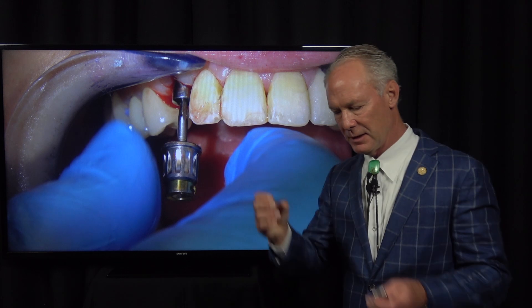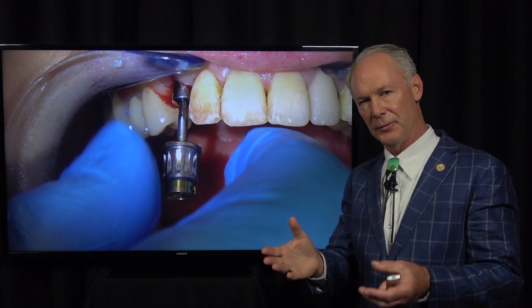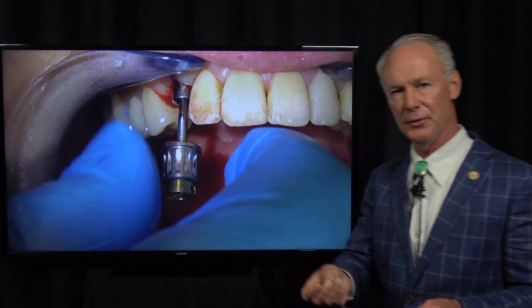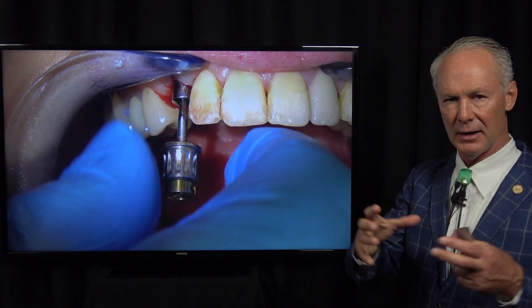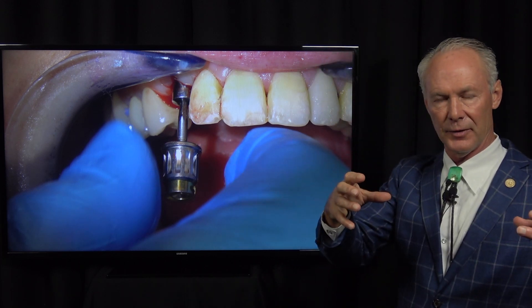One of the things that can happen is if the emergence profile from the implant is not at least as wide as the crown and abutment, when you screw those into place it can interfere with the complete seating of the crown and abutment, which can potentially lead to screw loosening. So be sure there's not a lot of pressure on the implant crown and abutment when they're seated. You want this healing abutment to be wide enough that the orifice is a little bit wider than the final implant abutment and crown.